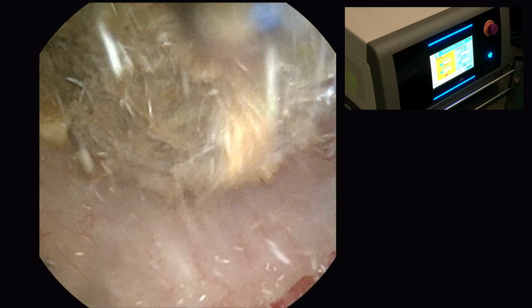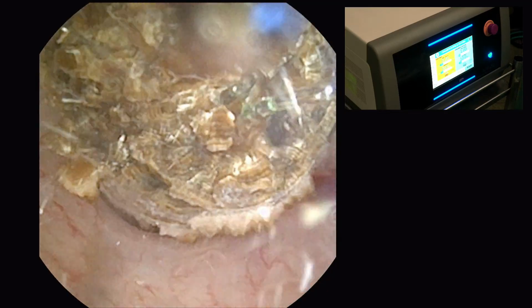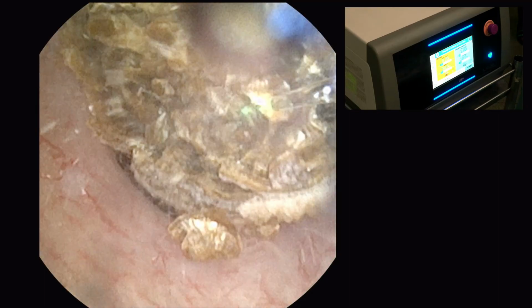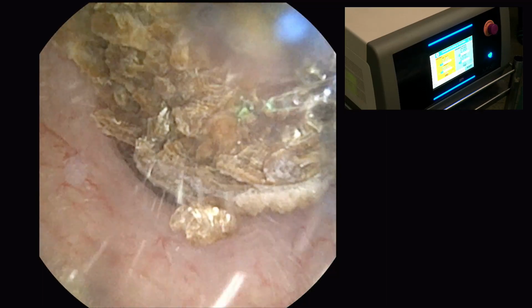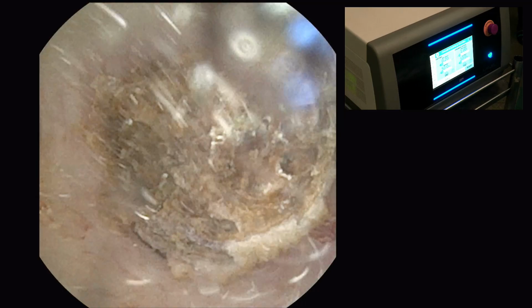Dr. Sajad, I have a question: at what level will you prefer keeping your access sheath, the upper end? A very good question. It depends upon where the stone is. If your stone is in the pelvis, because you don't need more bending of the scope, you can keep it just at the PUJ or the upper ureter. But if it is in the calyces where you need a deflection, then your scope has to be somewhere up, in the middle of the ureter, because the scope will not bend if your sheath is going there. Only 3 instruments. Thank you, sir.